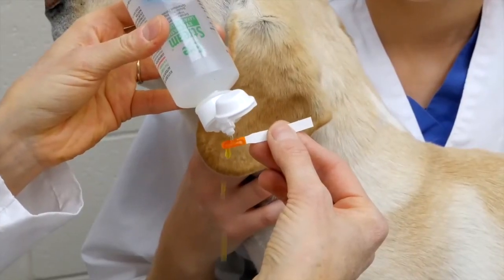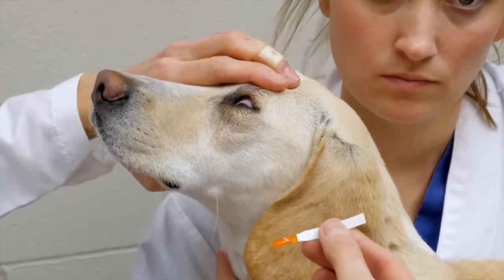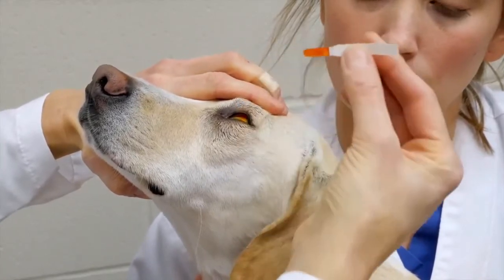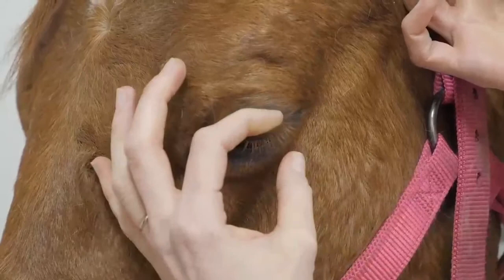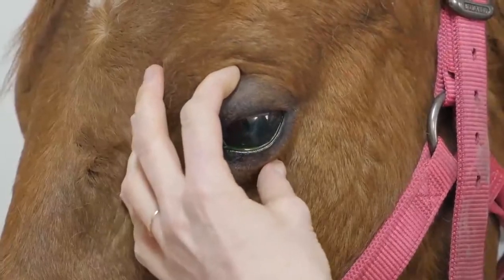Several methods can be used to apply fluorescein dye to the eye. However, the recommended method is to moisten the strip with sterile eye wash, and then to very briefly apply the moistened strip directly to the dorsal bulbar conjunctiva. Direct contact of the strip with the cornea should be avoided, as it will result in artificial stain retention.